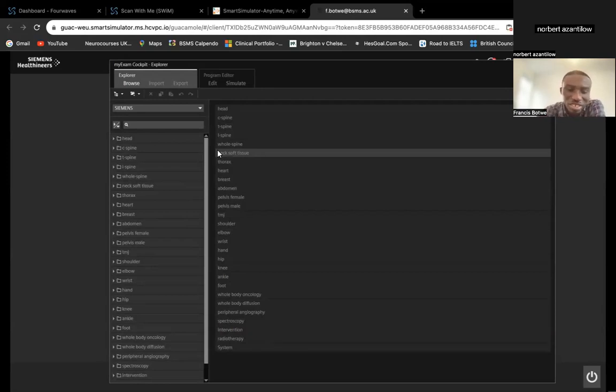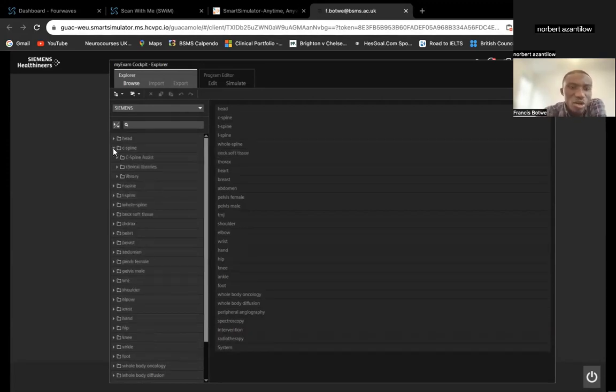Because all these processes take a longer time to upload and export. And there are some limitations, because it's owned by the vendors, they might not want you to import it or export it onto your systems. So there was a limitation like that. I don't know if that is the reason why I'm facing some challenges now. But you can still export it. And the format, everything is there. So it should be easy for you to do that.